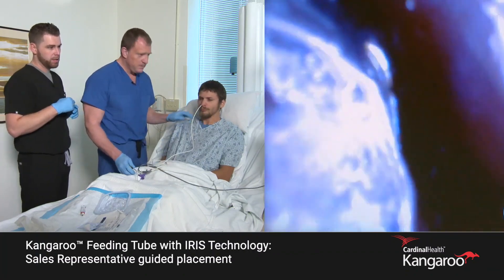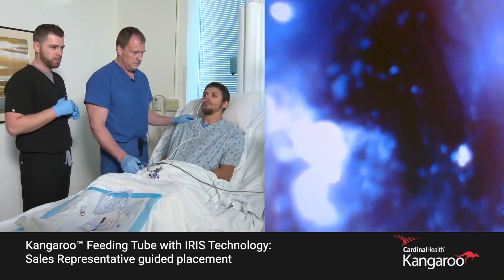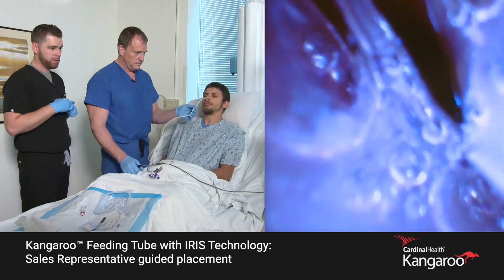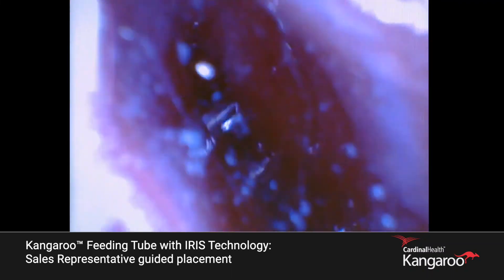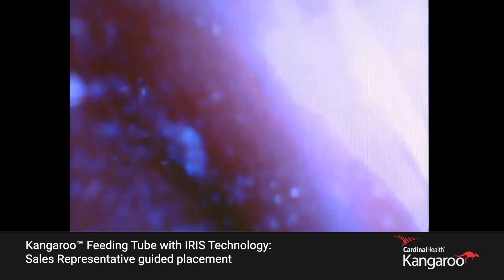The tissue is oblong and smooth. We're going to give it a puff of air and watch it push out — you'll see the distension of the anatomy. We have saliva present, which is great. Now let's see if it collapses back around the tube. Watch it close completely around the tube — perfect.